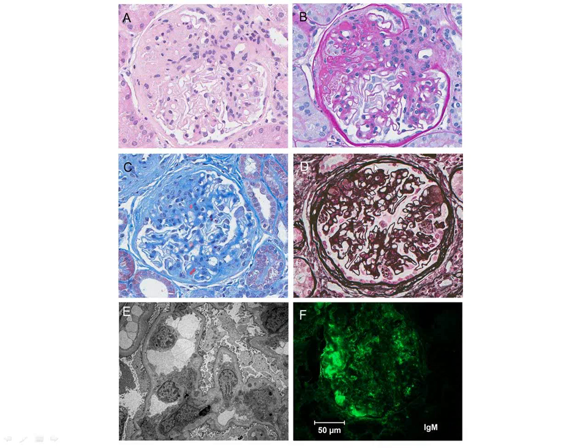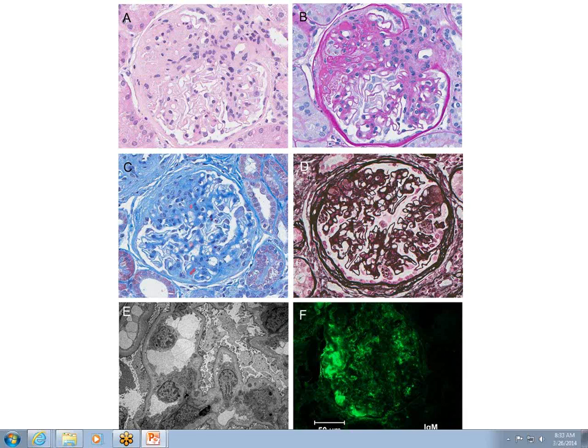There is some lamination of Bowman's capsule basement membrane noted specifically on the trichrome stain over here and on the silver stain. And that's a lesion, as an aside, that we often see in glomeruli that have synechia. I'll talk a little bit more about what we think that means. Okay, so histologically, we've talked about segmental sclerosis, the synechia, the protein droplets in the podocyte, and the hyalinosis, and then the fact that the rest of the tuft, although it has mild mesangial hypercellularity, has a glomerular basement membrane that is not thickened.